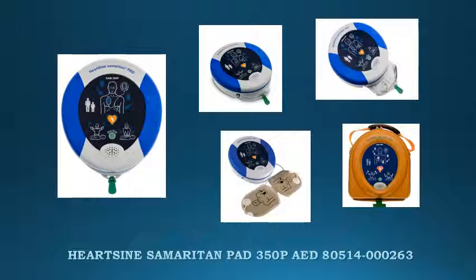It is easy to use and simple to own. The package includes the HeartSign Samaritan Pad 350P, one adult pad pack with a 4-year life, one standard carry case, an 8-year warranty, and user guides.